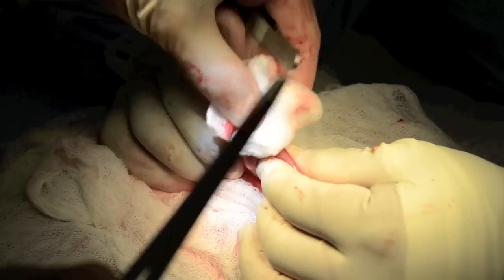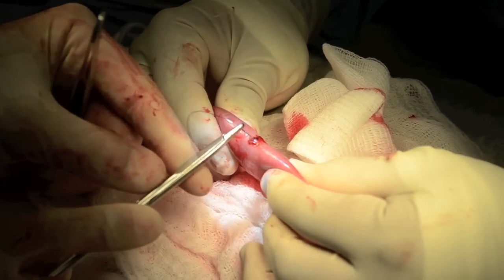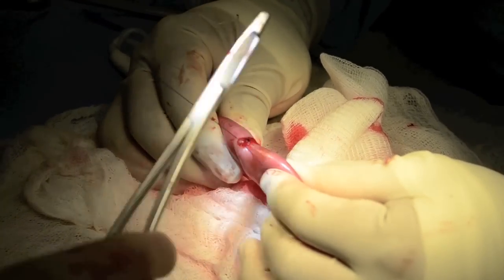The submucosa is the suture-holding layer in the intestine. It is important after the first suture is placed that we are taking full thickness bites to ensure that we adequately engage the submucosa.